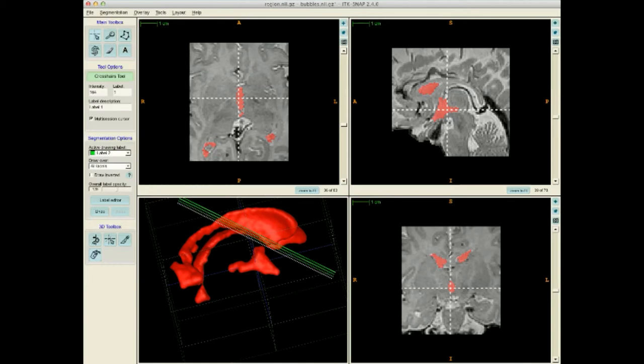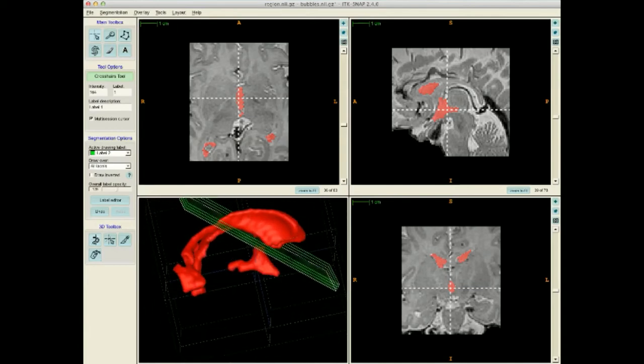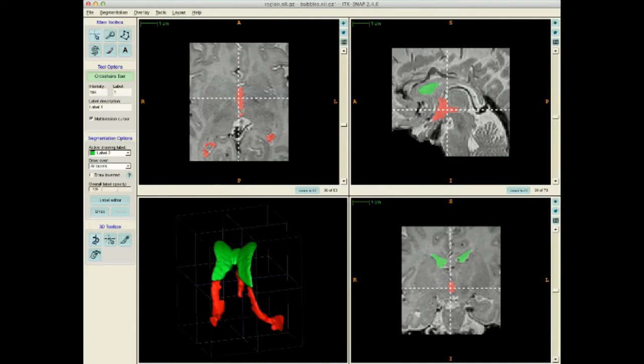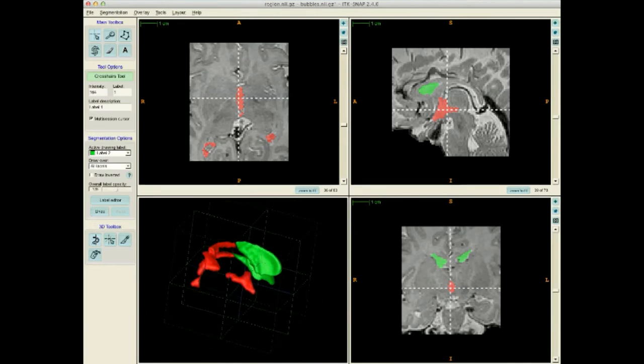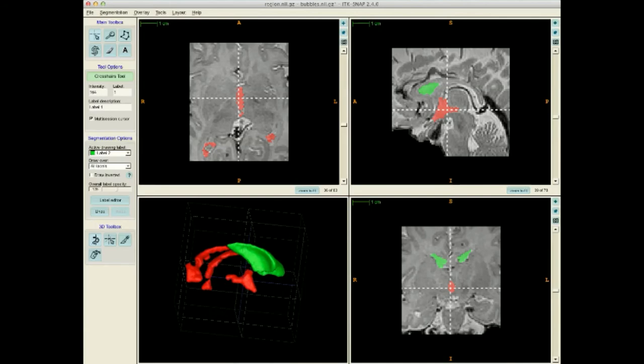So okay, do you think that's good? It's a little bit inconvenient. You have to switch between these two modes in order to see it. So you don't forget to click, otherwise you will override the previous cut plane selection. Then you click accept. Actually, in the slice window, you can see already it turned green. But here you have to update mesh. And unfortunately, it will reset the view, then you have to rotate again. So that's a little bit inconvenient, but nothing serious.